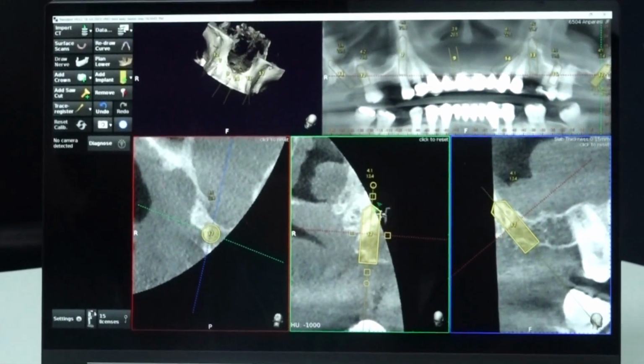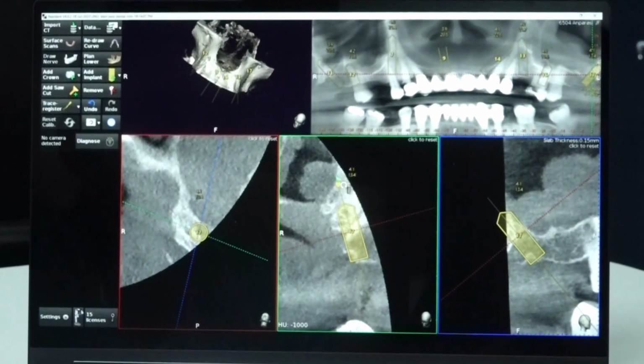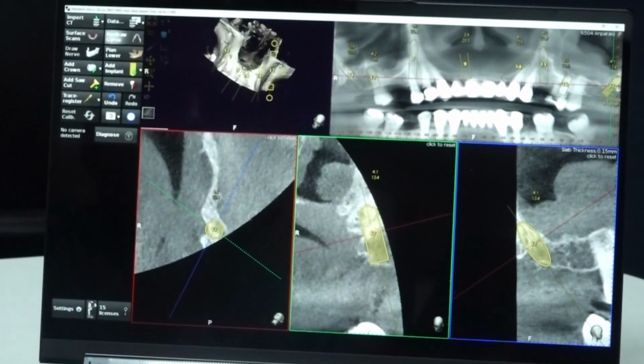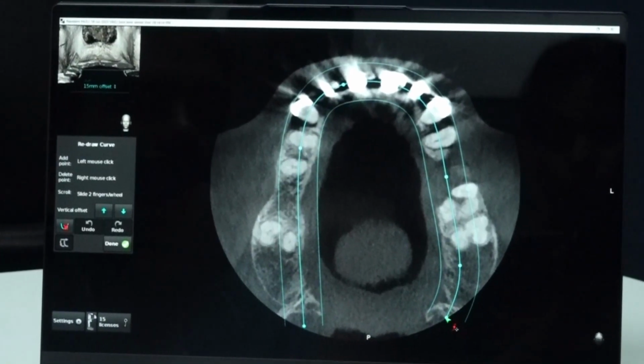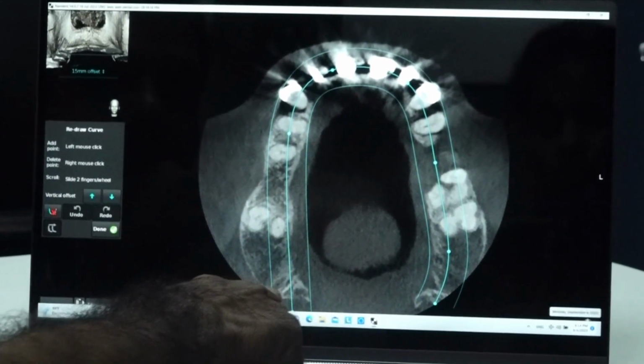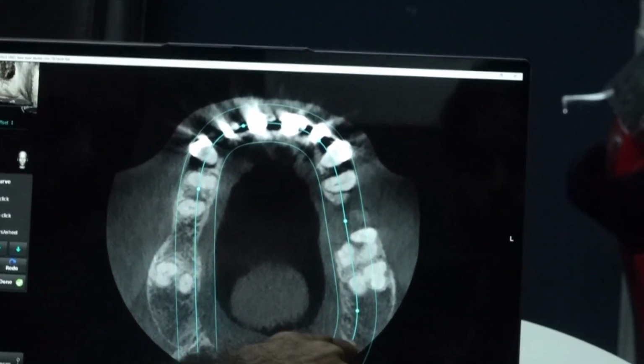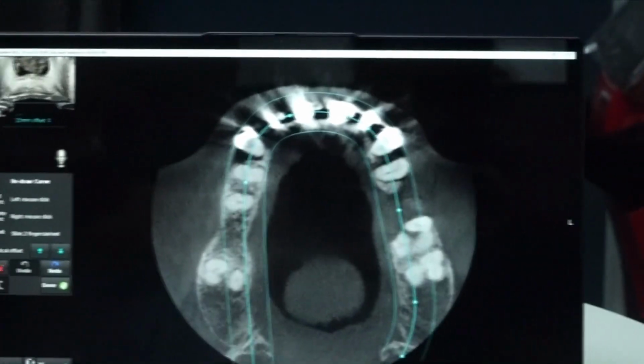You can place, but the pterygoid is fully covered in this cavity. See, no? If you see here, this pterygoid has come fully. Oh, sorry. But here, this pterygoid, no, it has not come fully.